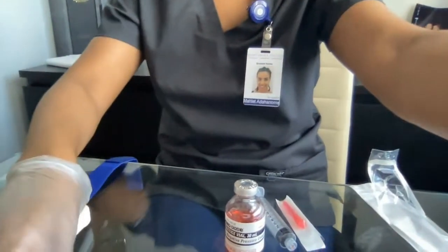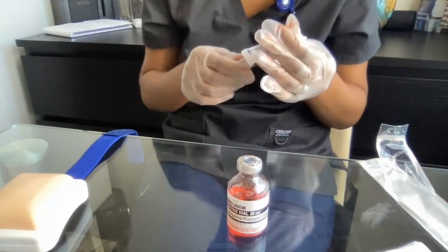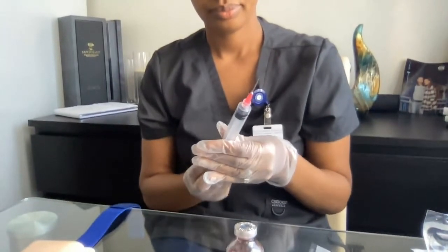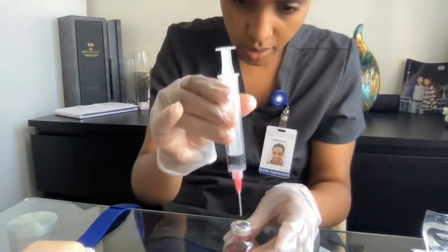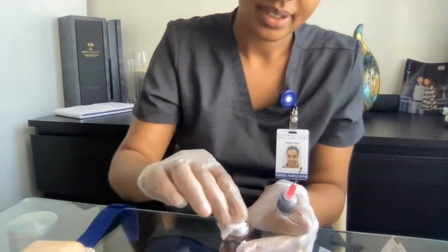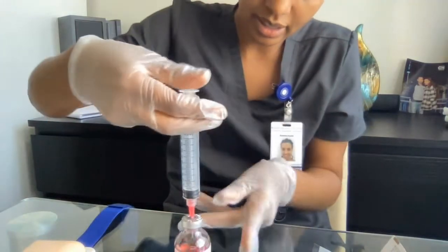So I'm going to go ahead and show you here. I'm going to draw 1 milliliter of air. Before I inject, I make sure I clean the tip for a good 5 seconds, thoroughly. And then I can inject the air in.